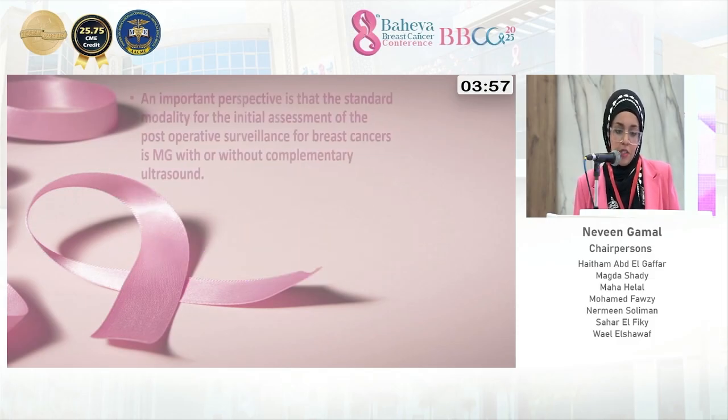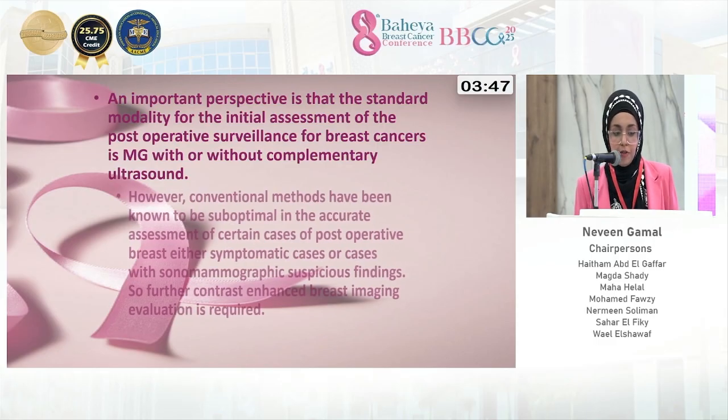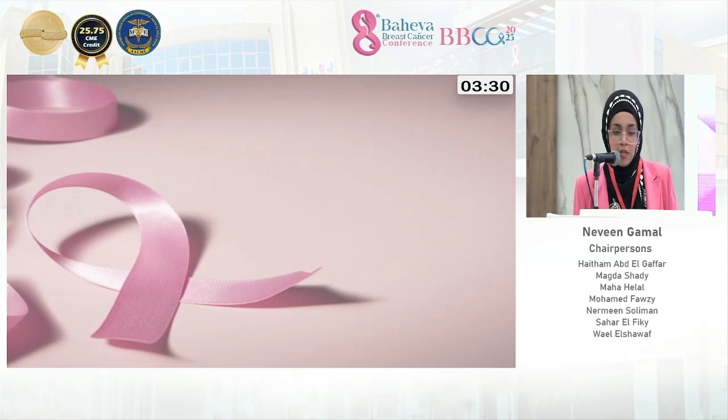So our take-home message, an important perspective is that the standard modality for the initial assessment of the post-operative surveillance for breast cancer is mammogram, with or without complementary ultrasound. However, conventional methods have been known to be suboptimal in accurate assessment of certain cases of post-operative breast, either symptomatic cases or cases with sonomammographic suspicious finding. So further contrast-enhanced breast imaging evaluation is required.